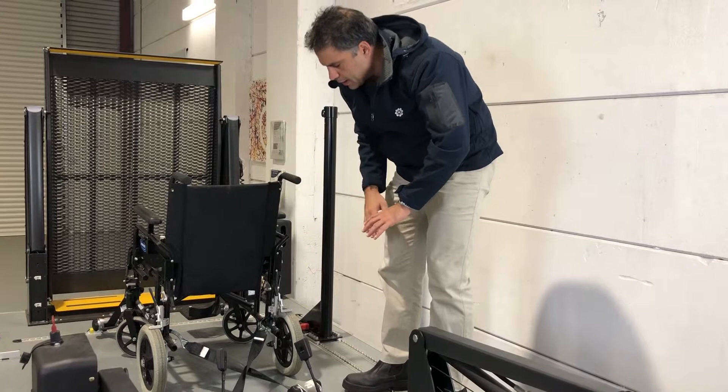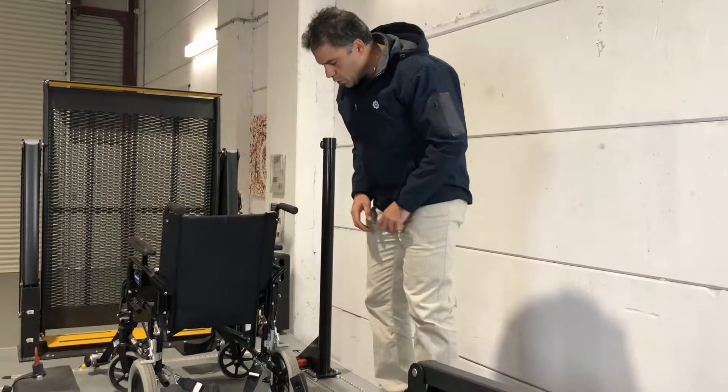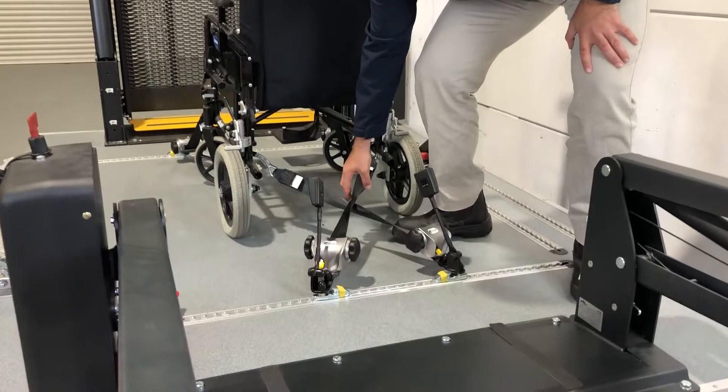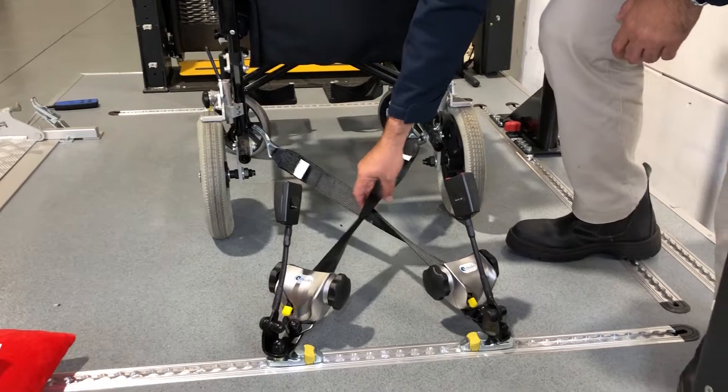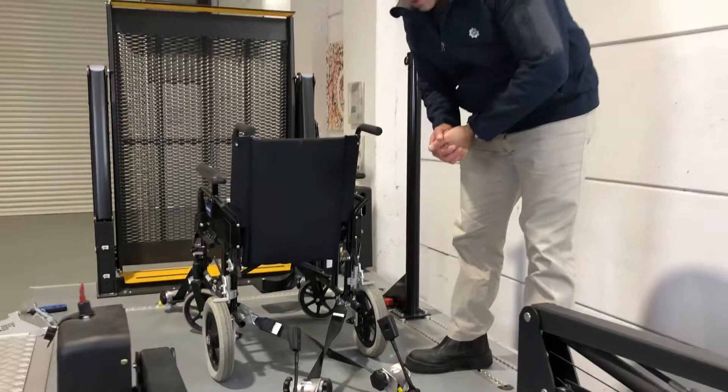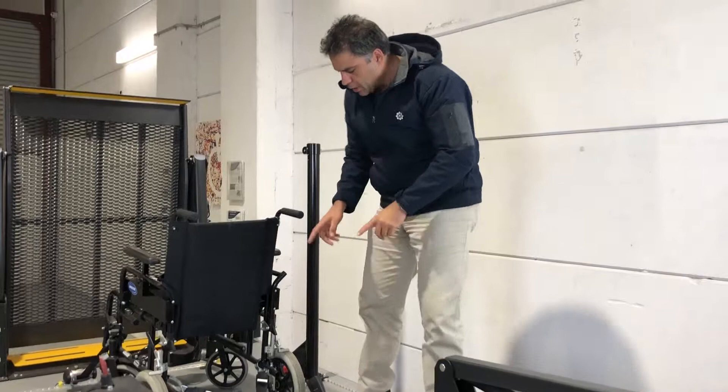Now I'll explain the reasons why. First, I'll show you how this is set up and what the issues are, then I'll show you the correct way. The first issue is that you'll see the restraints will often touch each other. When they're touching like that while driving, they're going to vibrate and wear away at each other over time. So your restraints, which have a 10-year recommended lifespan, will wear away within a few months and you'll have to replace them. That's definitely one big reason why not.